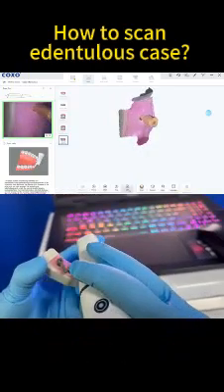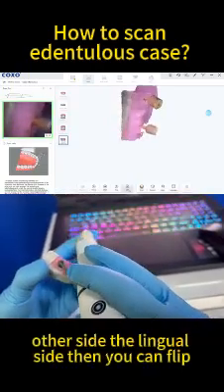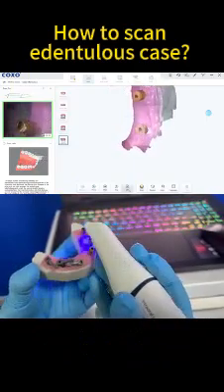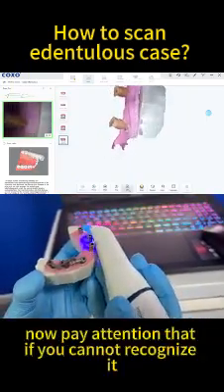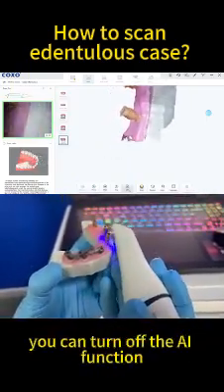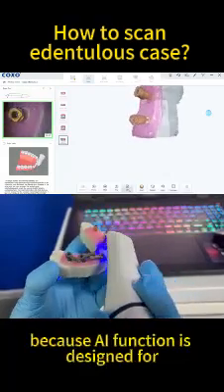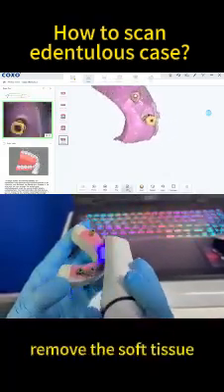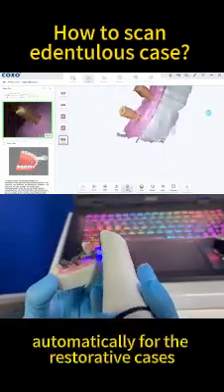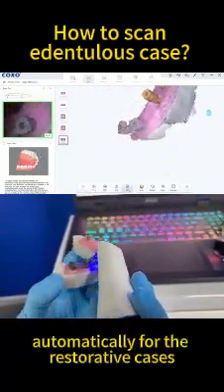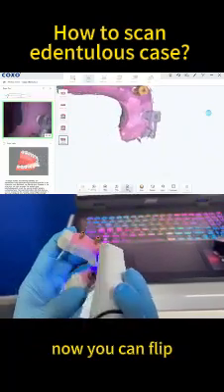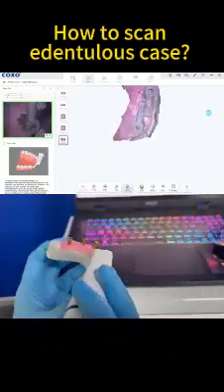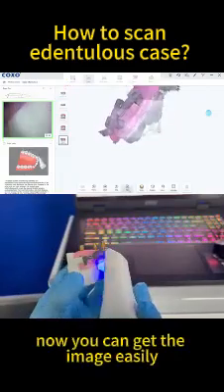Now flip to the lingual side, then you can flip. Pay attention: if you cannot recognize it, you can turn off the AI function, because the AI function is designed to remove the soft tissue automatically for restorative cases. Now you can just flip and get the image easily.